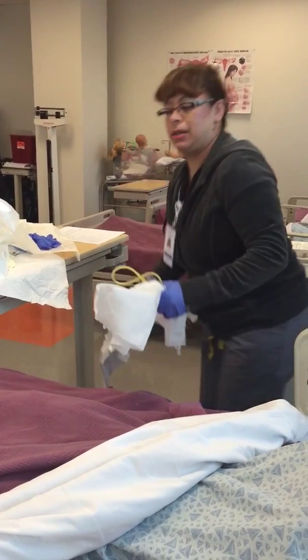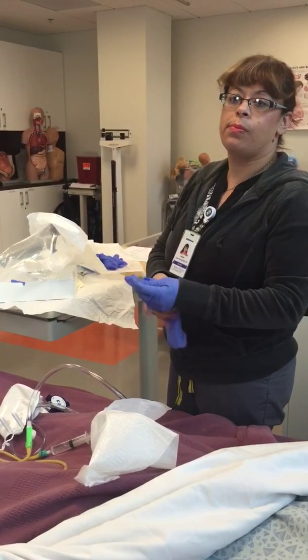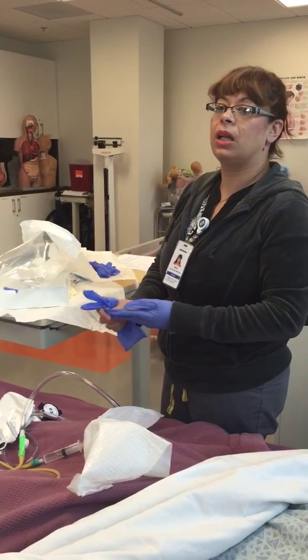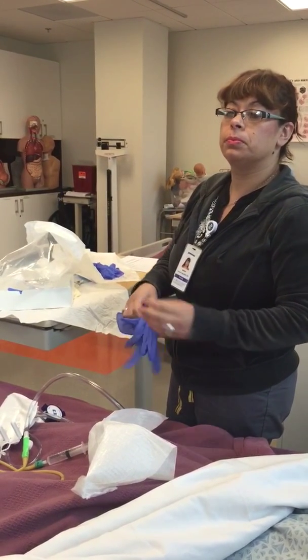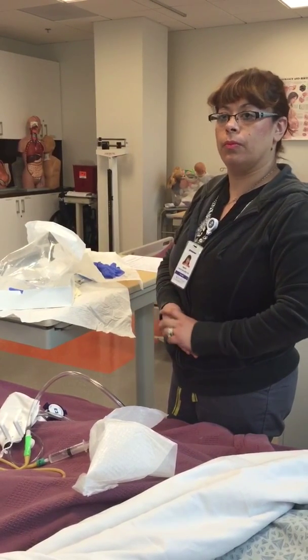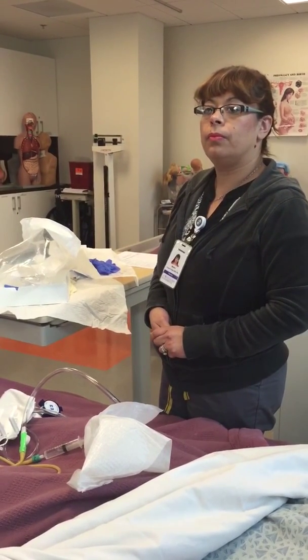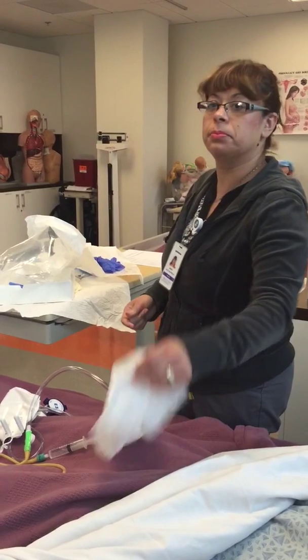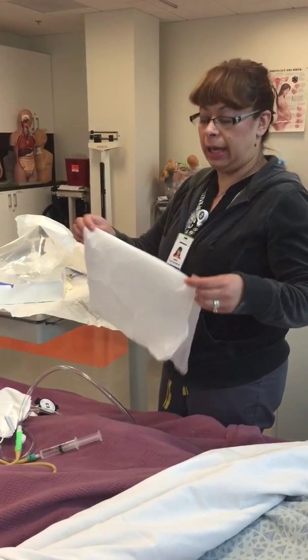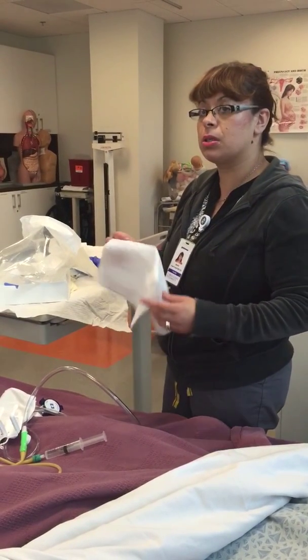Anybody have any questions? Yes. When you expose them, and let's say they have yeast or some type of infection, or just basically the private area is not clean, you need to clean it. So will we use the normal saline that's next to the bed? No, you can just use some warm soapy water to provide the peri-care. Yeah, and we should be providing care anyways once we put in a catheter, at least every 8 hours.